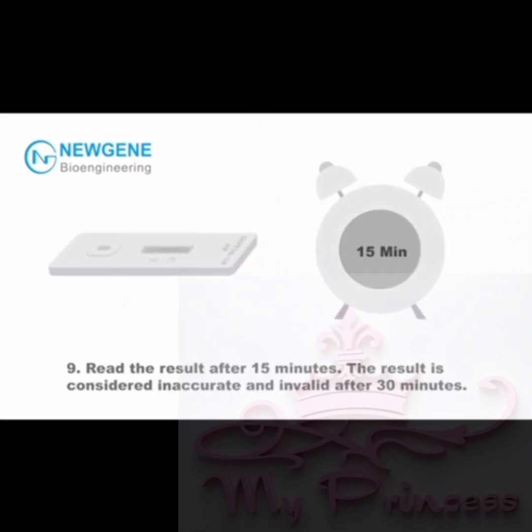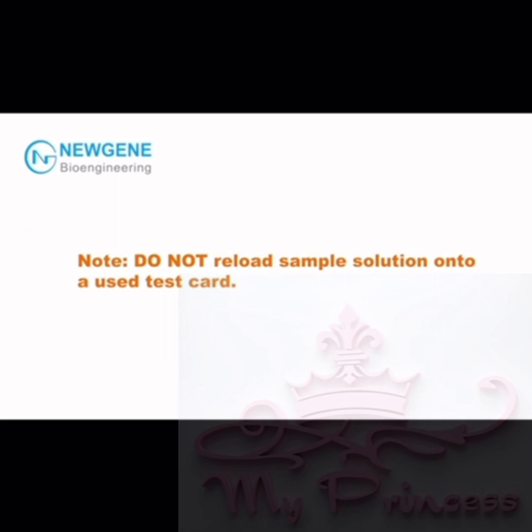Step 9: Read the results after 15 minutes. The result is considered inaccurate and invalid after 30 minutes. Note: Do NOT reload sample solution onto a used test card.